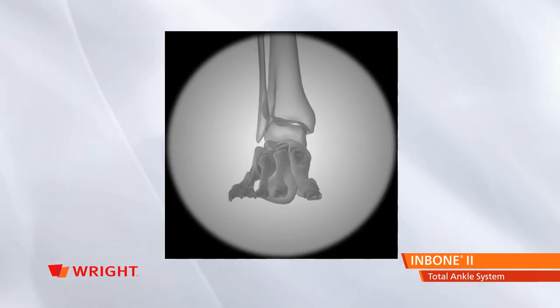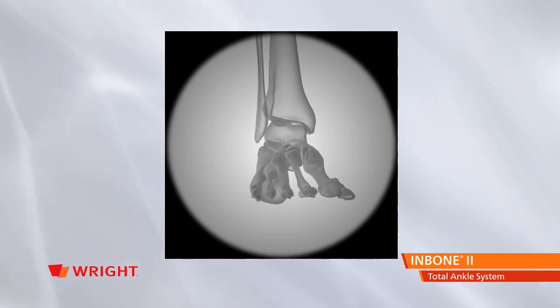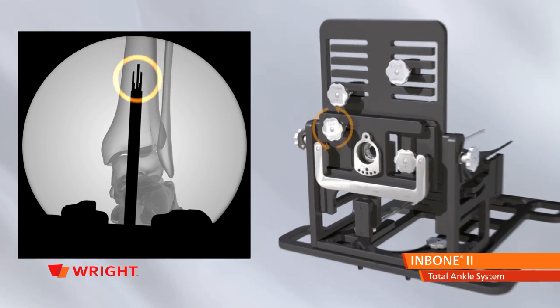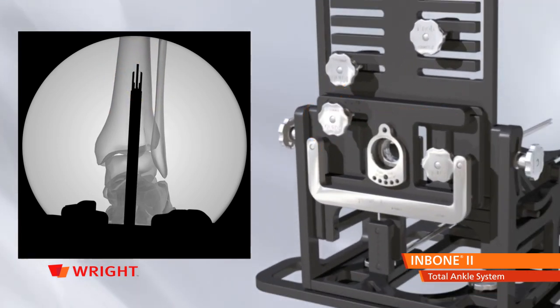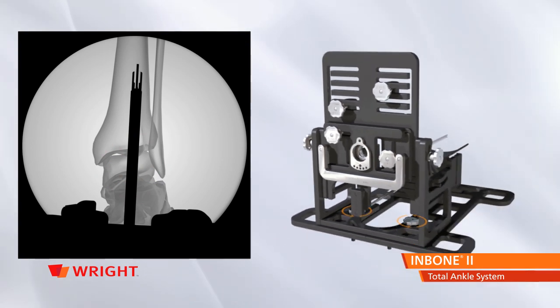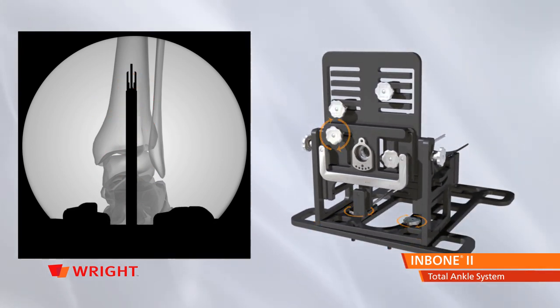To obtain the mortise view, rotate the ankle approximately 10 degrees internally. Align the guide rods under fluoro. Center the AP rods on the talus using the ML plate, then rotate the U-bracket until the AP rods are in the center of the tibia, verifying each movement with fluoro.